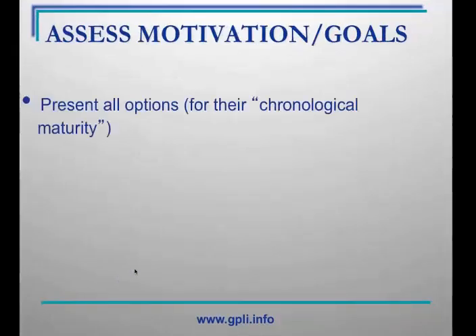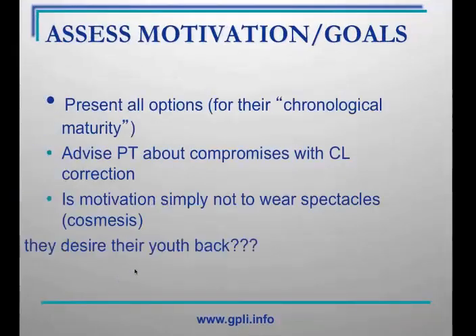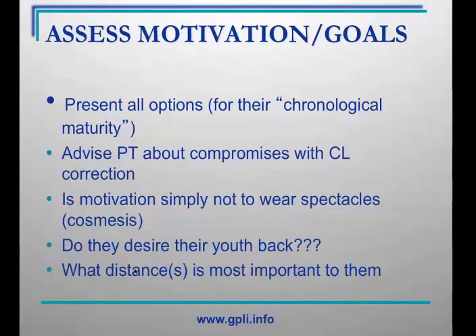Of course, the first thing I will do is give you 5 options when it comes to assessing motivation and goals. But I think if you look at these factors, these are the key ingredients when you're talking to any presbyope about contact lens multifocals. Be sure to present all options to them. I always emphasize the contact lens multifocal option. If they opt for soft multifocals, that's certainly acceptable. If ultimately they are not pleased with their vision from this correction, however, they've been told that GP should be a viable option, and it makes it easier to then refit them into that modality.